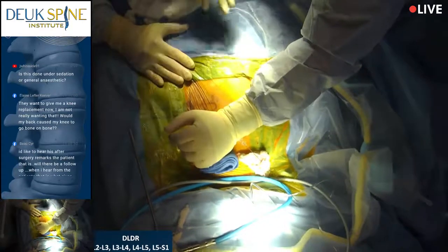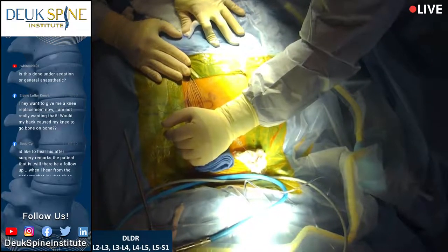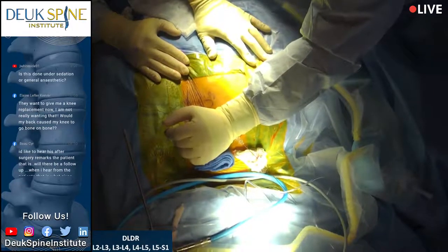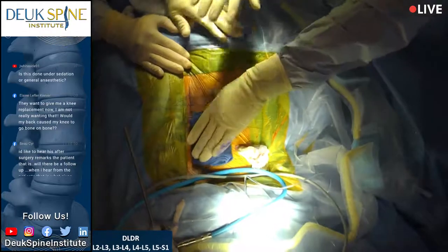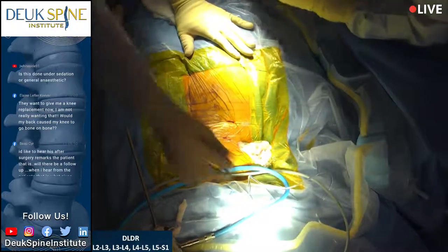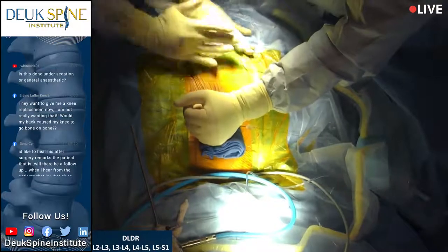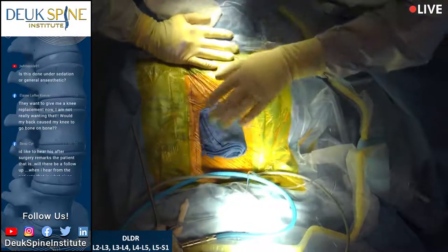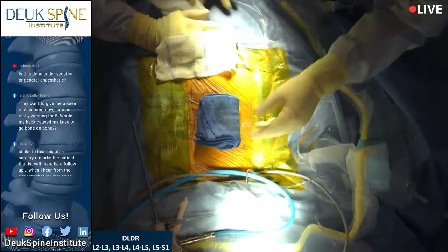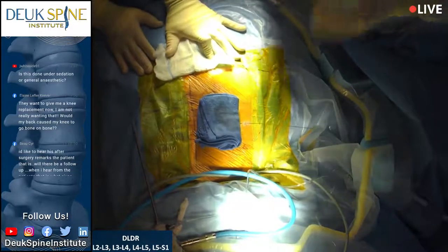And do we have any more questions from our audience? Yes, we have a question from Jay Whiteside on YouTube. Is this done under sedation or general anesthetic? Hi, Jason. Great question. So this lumbar or lower back procedure and thoracic disc procedure are done under propofol sedation, not general anesthesia. We do the cervical laser surgery under general anesthesia. So this is sedation. And we have our anesthesiologist and our nurse who are closely monitoring the patient to make sure that he's safe, he's breathing, and he's comfortable.